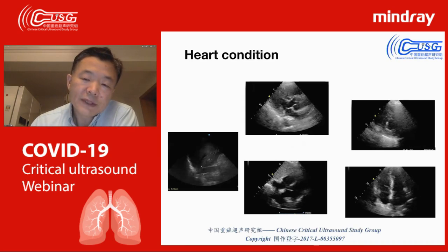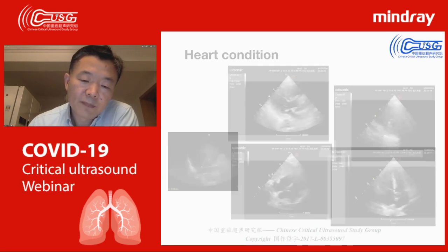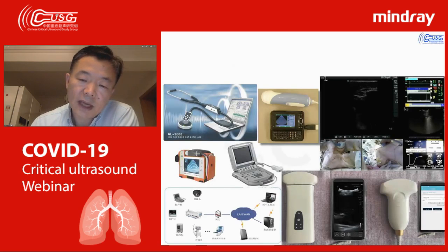So after that, we all know our ultrasound machine has gone from very huge volume to now more small and easy to carry, even pocket-sized. So you see this kind of thing.